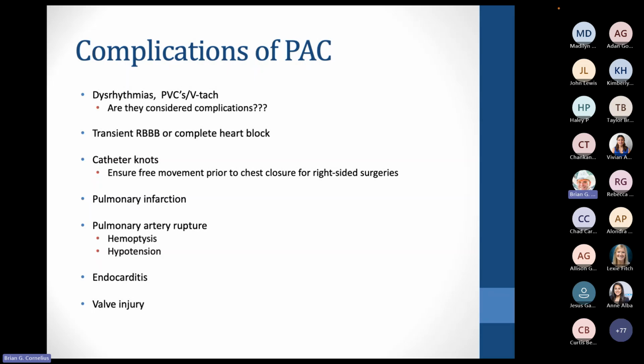It is possible to tie these catheters in a knot. Probably a bad thing to have inside your chest because you can't get it out very easily. What you'll see a lot of times is patients that are having open cardiac procedures, just because the way the patient's moved around, the way the heart's moved around, you may get a knot that's tied in that catheter during the course of the surgery.